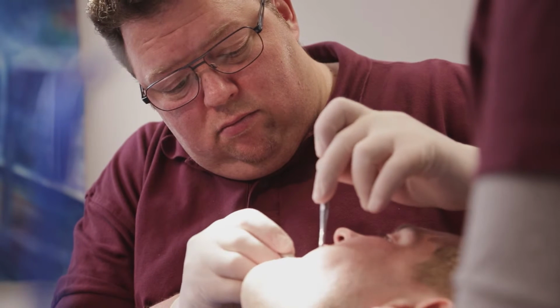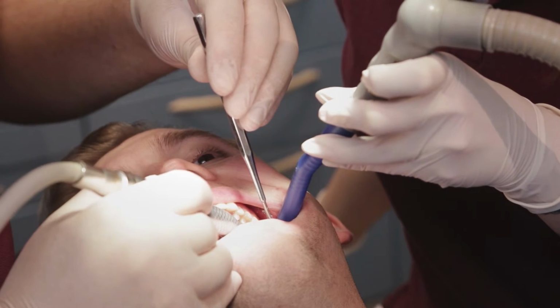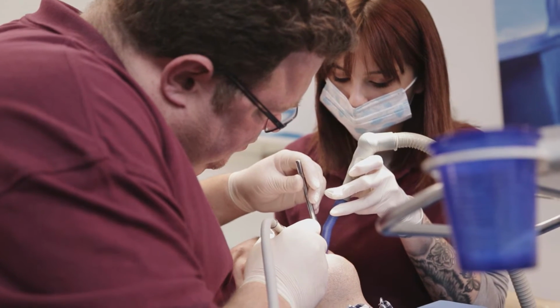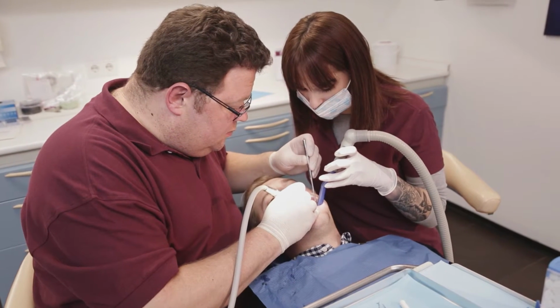For restorations in posterior teeth, the stability and durability of the restoration are especially important. I like to suggest monolithic zirconia restorations for the posterior teeth, because stress there is very high, and only metal or zirconium oxide ceramic can stand up to it over time. The veneered zirconia restorations are less stable, because a certain number of restorations will develop cracks in the ceramic veneer over time. And full zirconia restorations have a failure rate of 0. At least, I've never experienced any kind of failure. They do have some optical disadvantages, but these are not relevant in the posterior teeth.